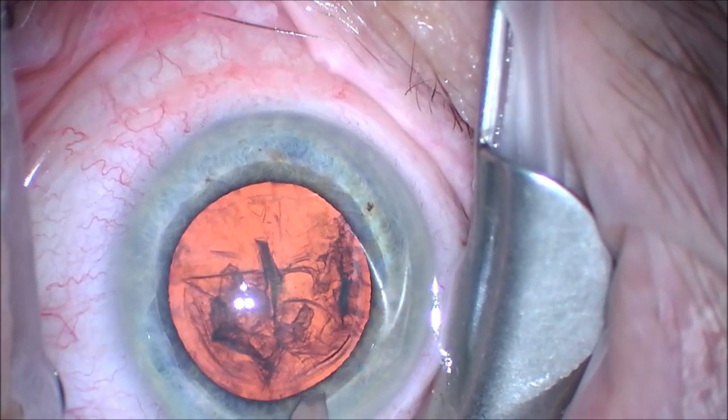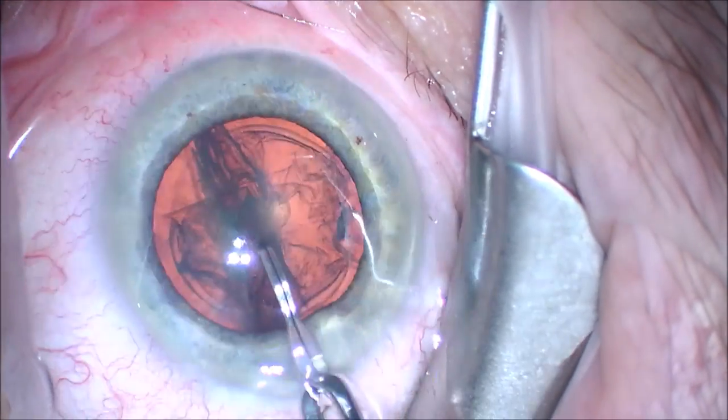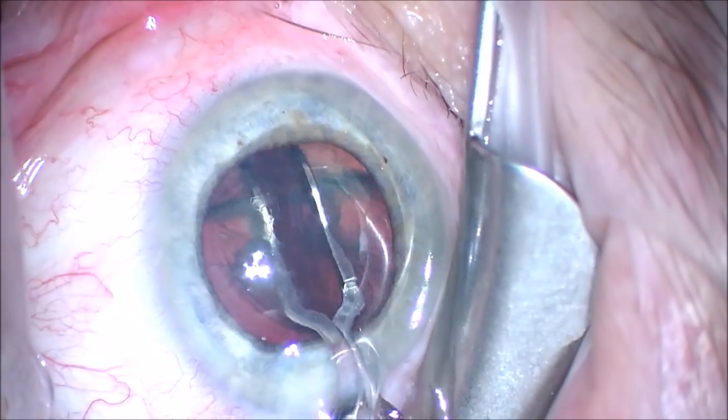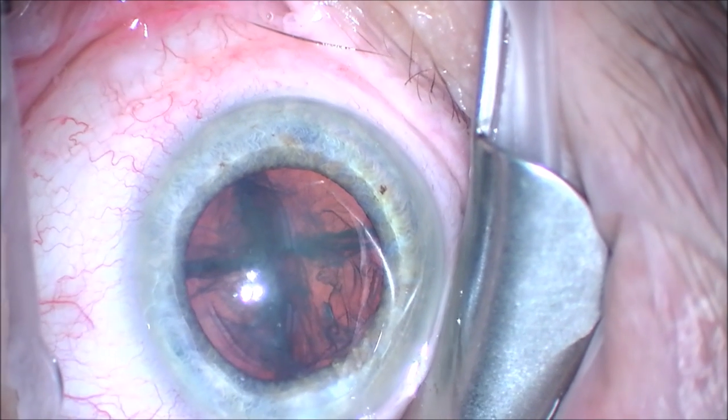We use a modified Akahoshi pre-chopper to break the cataract into four pieces, as you can see here. We turn the nucleus with the pre-chopper and chop it into four pieces, sort of forming a cross, making four equal pieces.